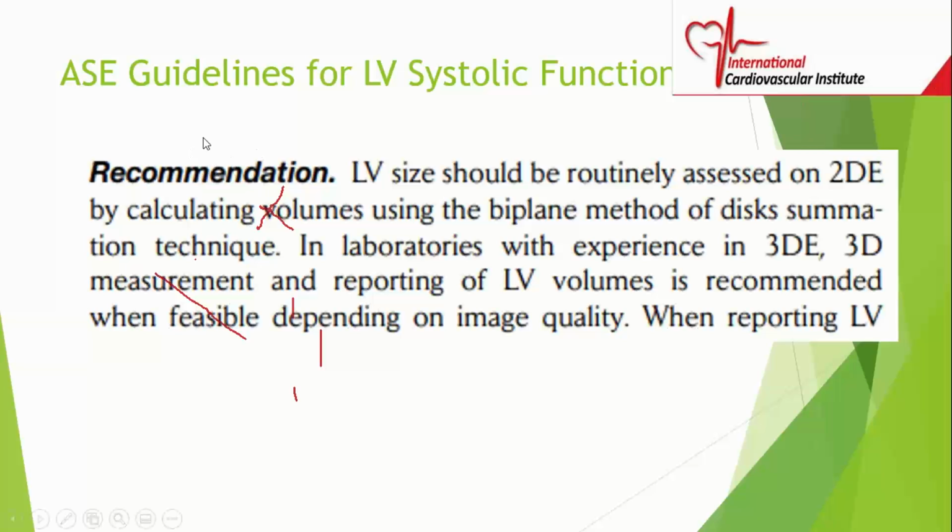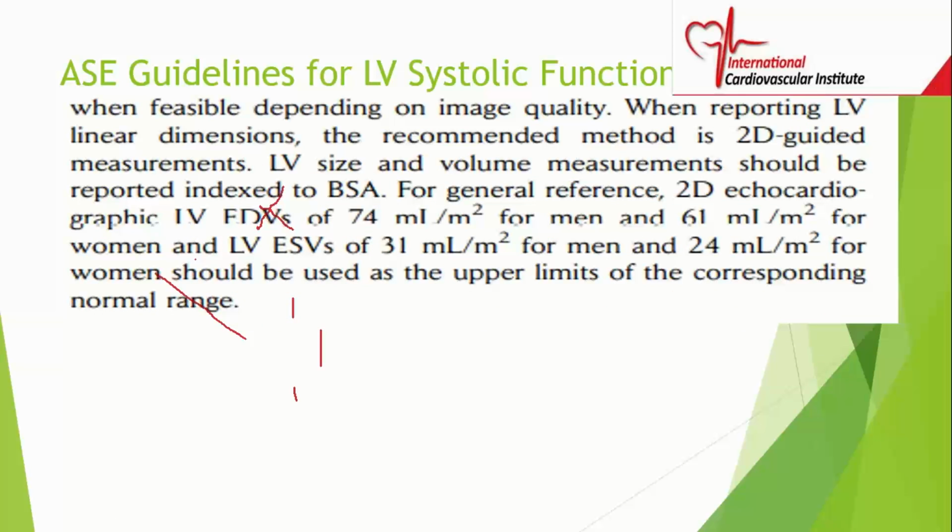The ASE recommends that LV size should be routinely assessed on two-dimensional echo by calculating volumes using the biplane method of disk summation. In labs with experience in three-dimensional echo, three-dimensional measurement and reporting of LV volume is recommended when feasible, depending on image quality.